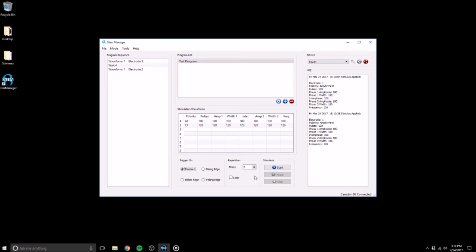With the basics of Stim Manager covered, now might be the ideal time to check out our video on StimX, the MATLAB API for the CereStim.